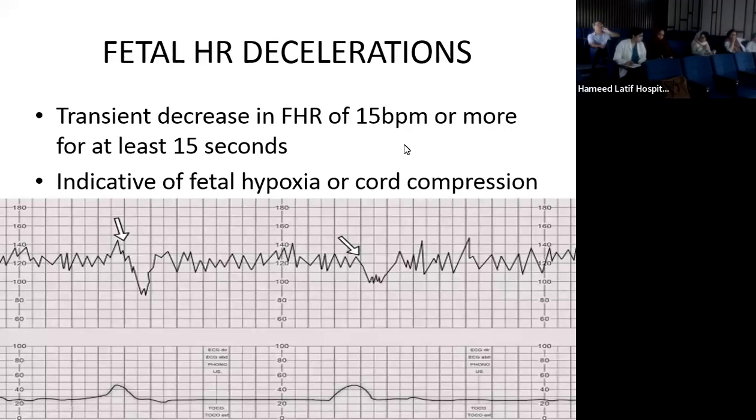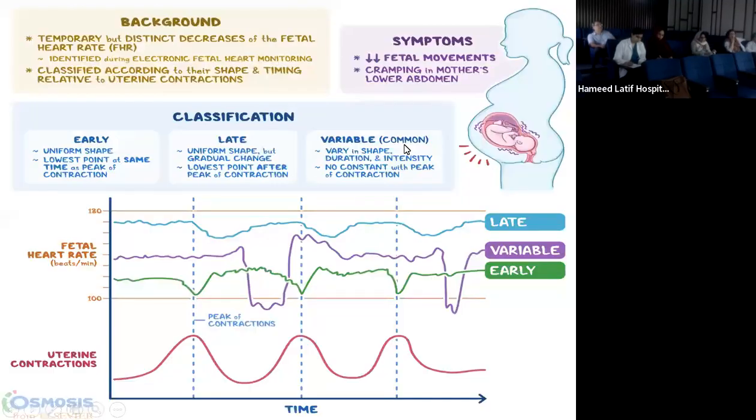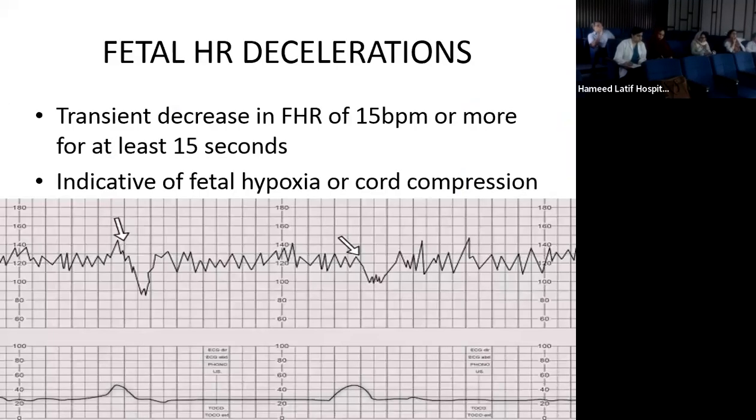All I'm trying to tell you is that if the acceleration lasts for more than 10 minutes, then it's a change in baseline.